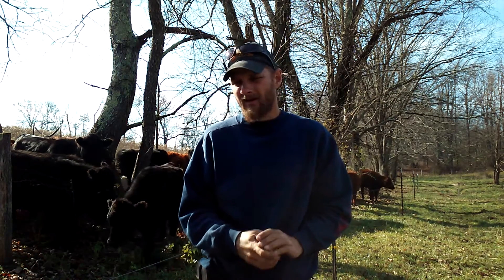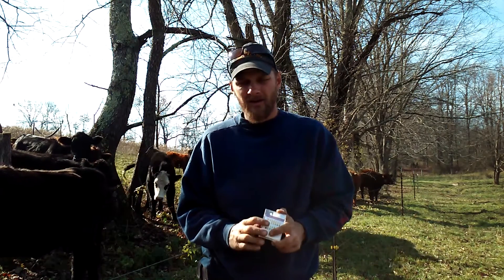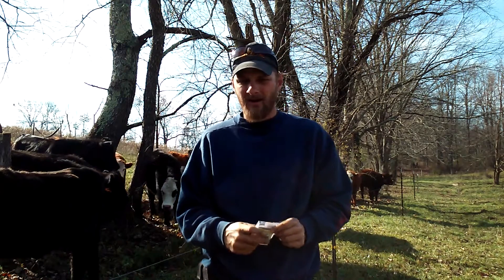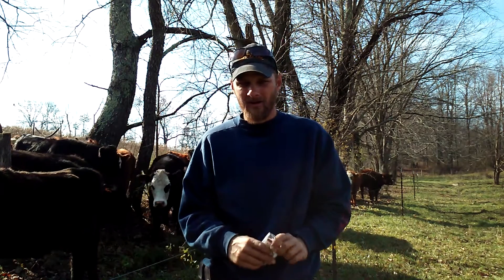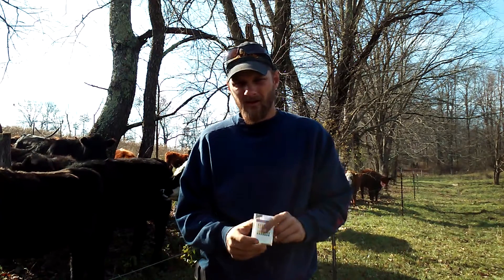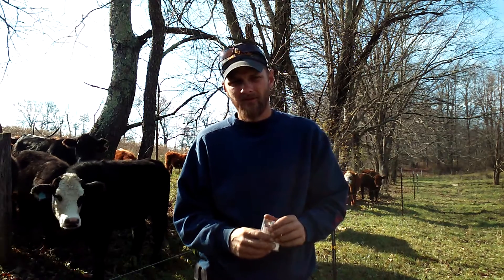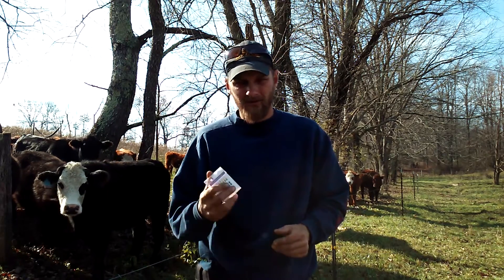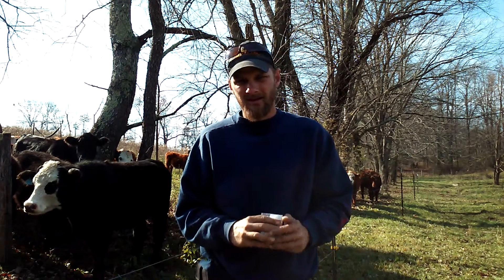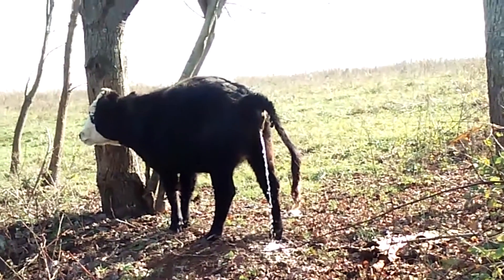After I got these strips, I was pretty anxious to get up here and give it a try. I came up here that day all excited about trying it, and I sat up here for probably a half hour. I've got 34 head here and nobody wanted to take a leak for me, so I didn't get to try them that day. A couple days later I was up here and kind of forgot about these, but I carried them with me on the ATV. And somebody just happened to go pee-pee and I had my strips and I was able to try it out.